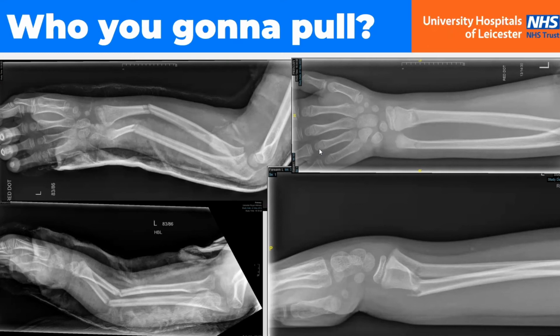So just remember, the upper right is the same as the lower right. So it's the same X-ray, it's just a different angle. Yeah, so the degree of angulation and the clinical deformity is important. So it can be a little bit difficult if there's not much deformity. When people talk about the degree of angulation, is there a number? Are there things that impact that number? Yeah. So yes. Completely right.